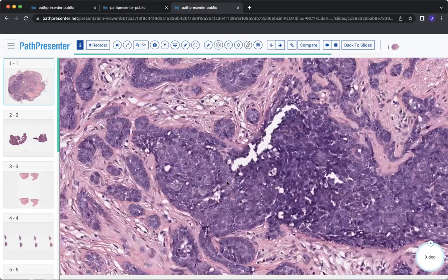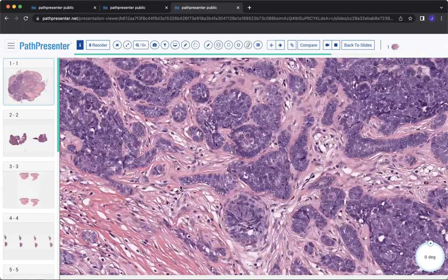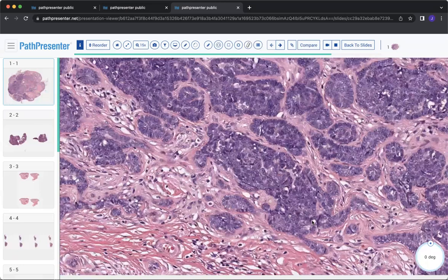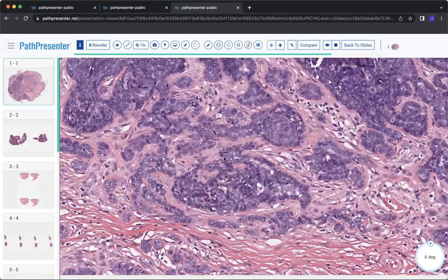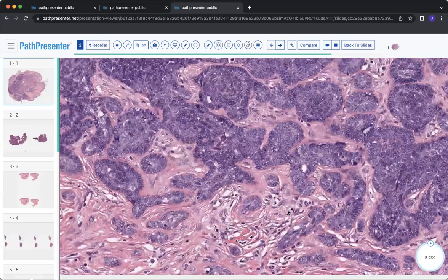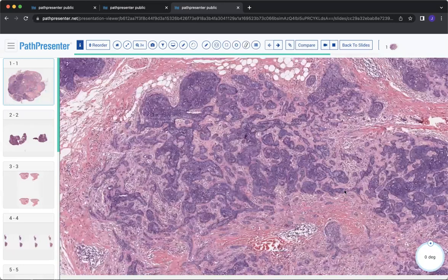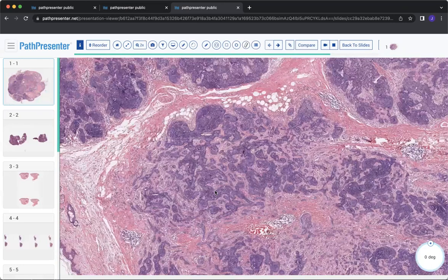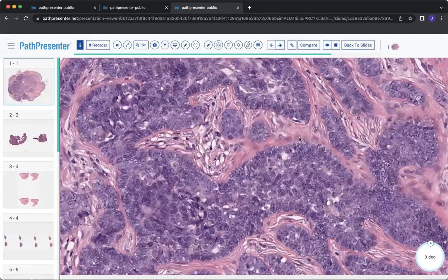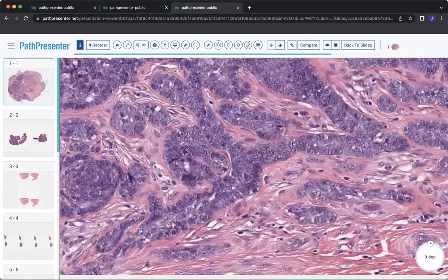And how do you tell the difference between a trichoblastoma and a basal cell? So a lot of it's going to depend on the context. So it could be a younger patient. It could be presenting in an area where there was no sun damage, things like that. The other thing is I've found that trichoblastomas can be quite large as well. But I would say that when you're on higher power, the stroma actually connects to the island in a way that's tighter. There's not a lot of retraction.